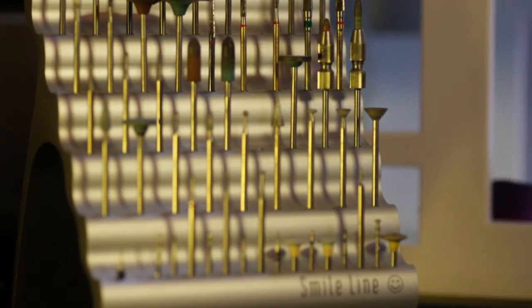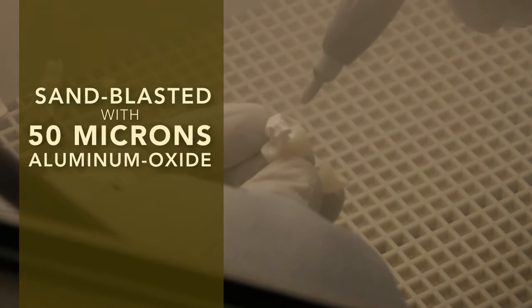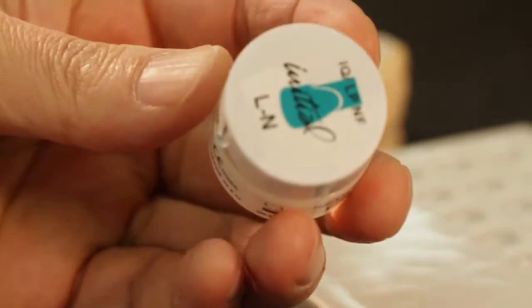Before applying the Lustre Coating, the ceramic restoration is shaped and contoured using adjusted diamond burrs. After this process, the finished crowns and bridges are sandblasted with 50 microns aluminum oxide at 1.5 bar pressure. The Lustre Paste Neutral is then coated on the entire surface of the sandblasted restoration — this coating is clearly thicker than what we know from a normal glaze firing.